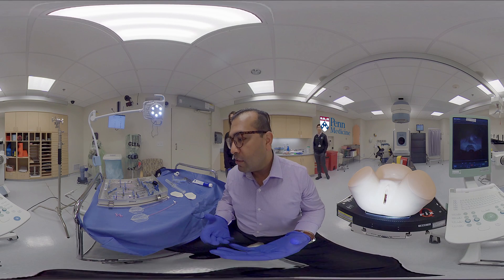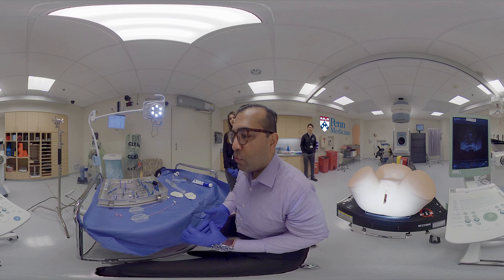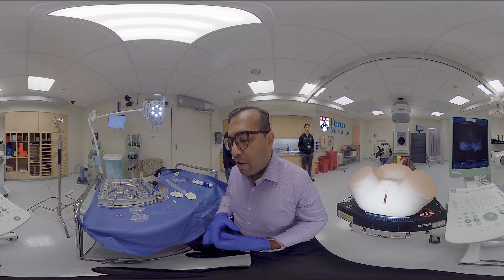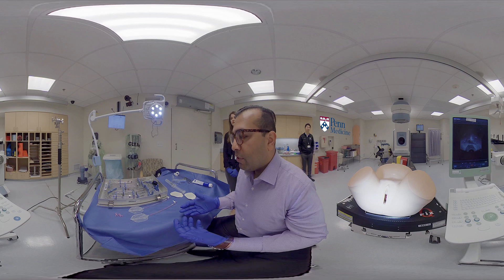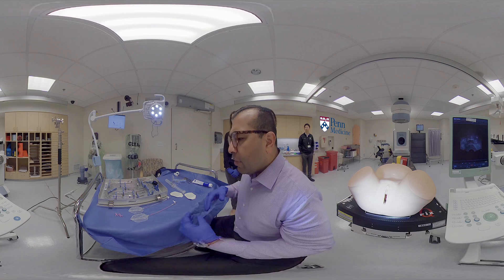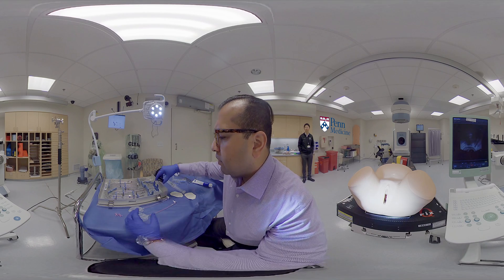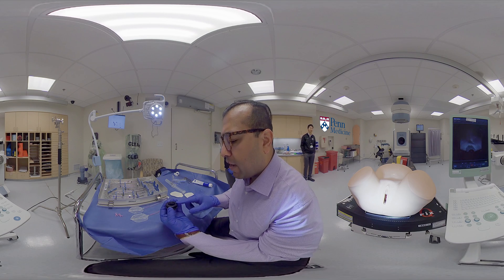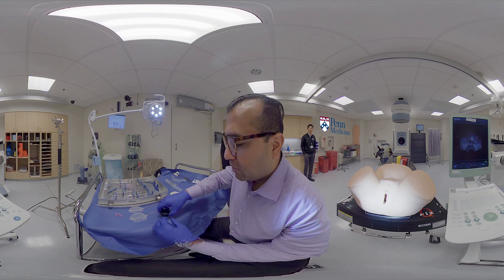Initially, we've already selected the intrauterine tandem length that we'd like to use. The kit comes in 2, 4, and 6 centimeters. We like to use the longest tandem that we have available. After an exam under anesthesia, I like to assemble the matching ring that I had planned to use. We select the appropriate size buildup cap — it comes in 5 and 7.5 millimeters. This is the 5 millimeter cap. We attempt to use the largest buildup cap that we can comfortably fit inside the patient.